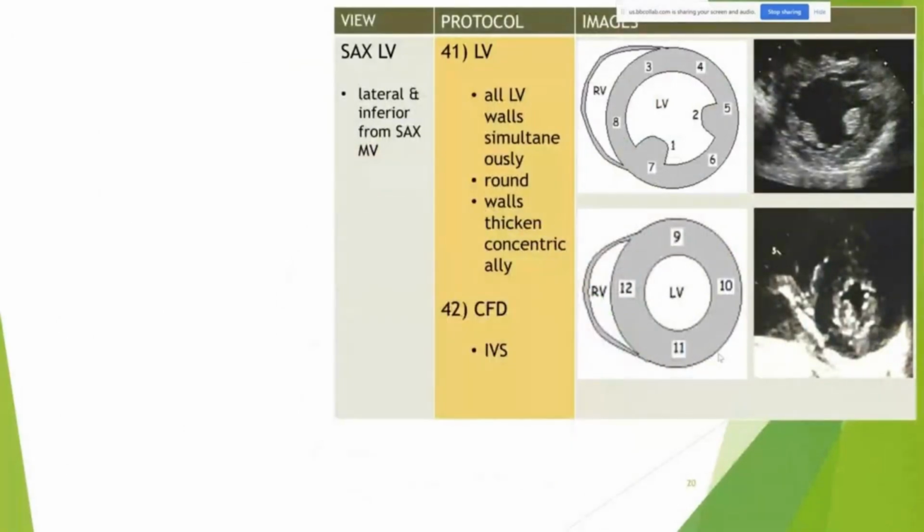All right. The last thing you need to know, I know Irina stressed these, the walls. Now it's important. So the cheapest way I remember this: late in September. I literally have an auntie who's always late everywhere, but I only see her in September. Whatever acronym you need to come up with.